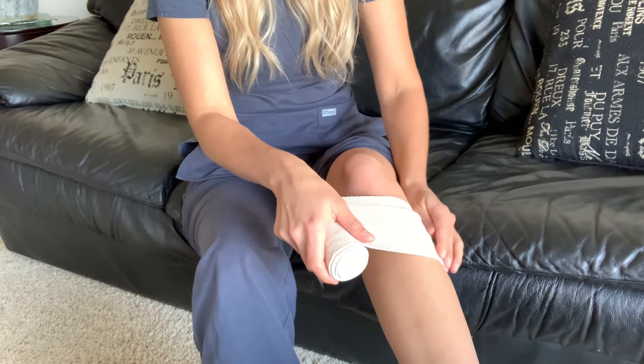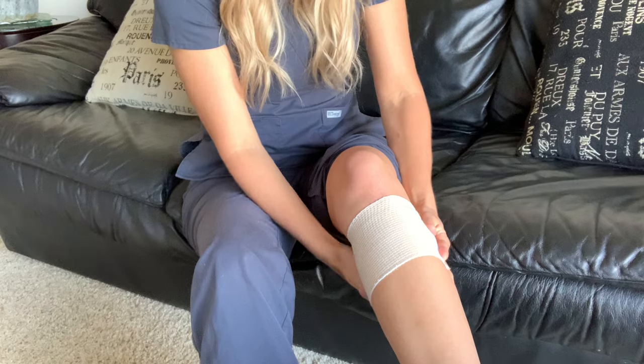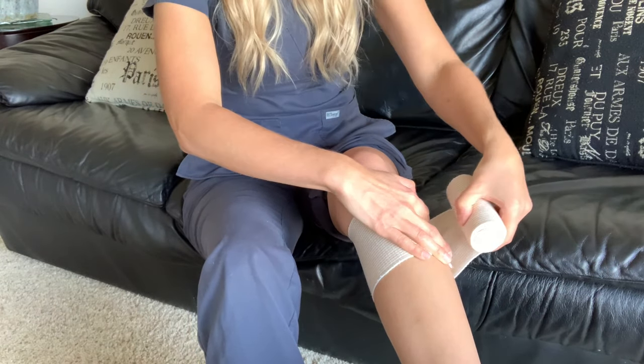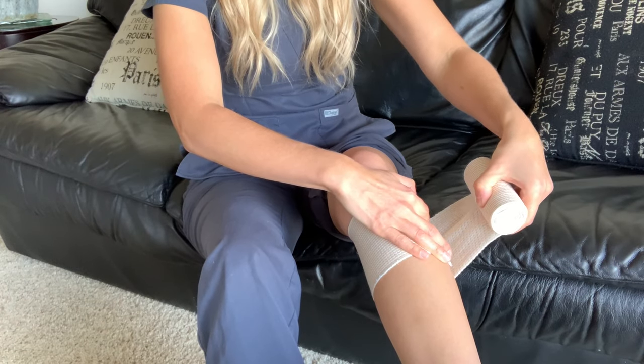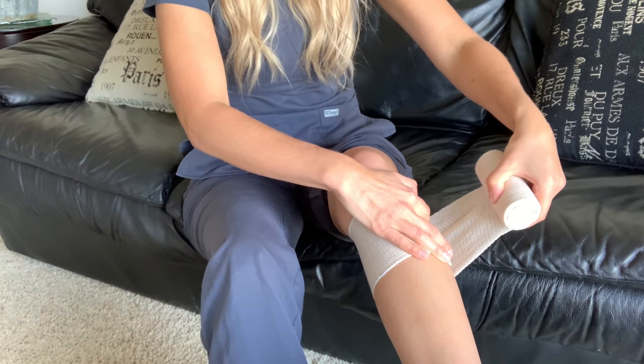Start below the knee — this one is nice because the Velcro helps secure that first wrap. You're applying about 50% tension, which means if the elastic bandage was pulled to 100%, its full capacity, you're only applying about 50% tension.